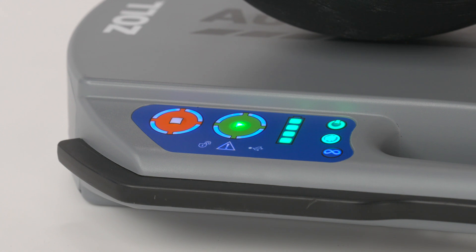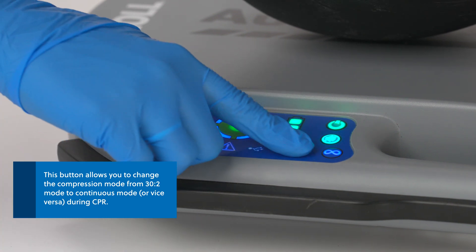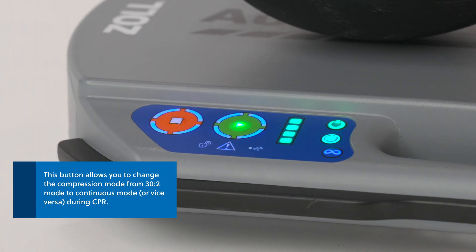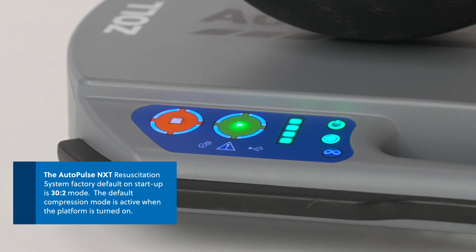The compression mode button is located next to the mute button. This button allows you to change the compression mode from 30 to 2 mode to continuous mode during CPR. The AutoPulse NXT resuscitation system factory default on startup is 30 to 2 mode. The default compression mode is active when the platform is turned on.